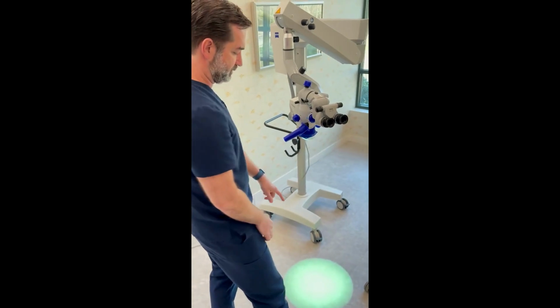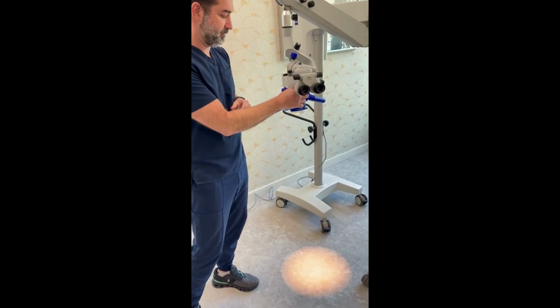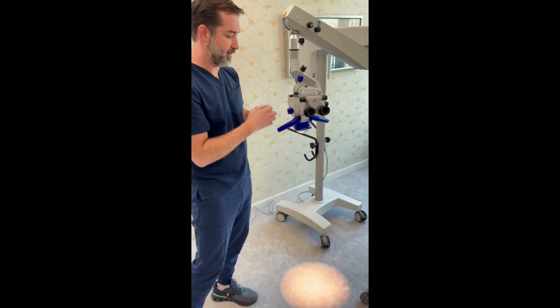Another good advantage of using a microscope like this is that the lighting on the field is something I cannot replicate with anything else. It allows me to see the procedure in the best way possible. And of course, the way that I can move it around during the surgical procedure makes it very easy for the surgeon seeing something at really high magnification to have a very delicate movement that doesn't, in the end, make it harder for me to perform the procedure.